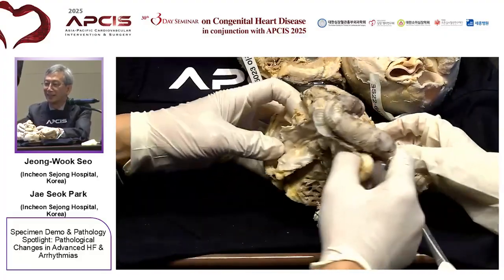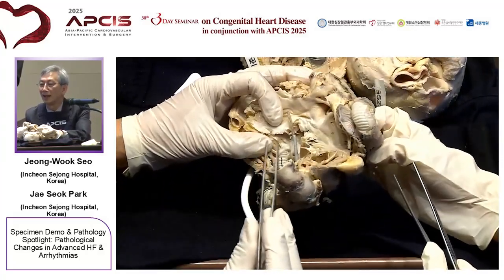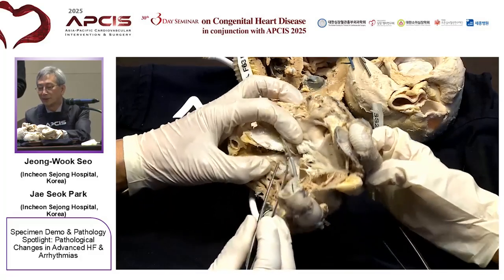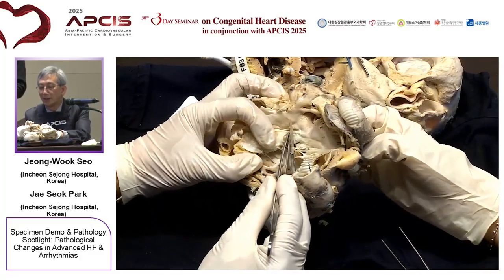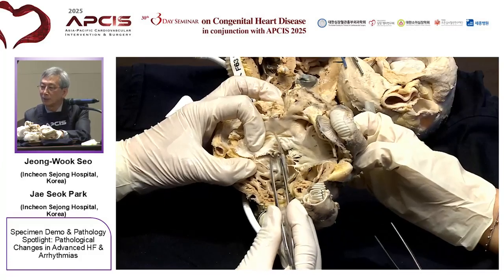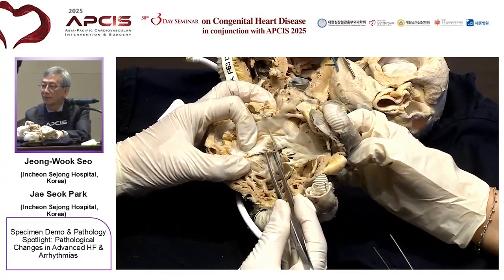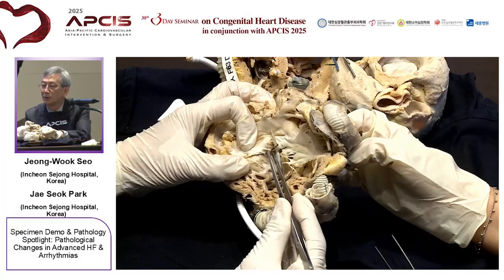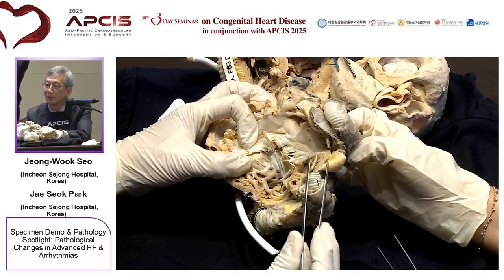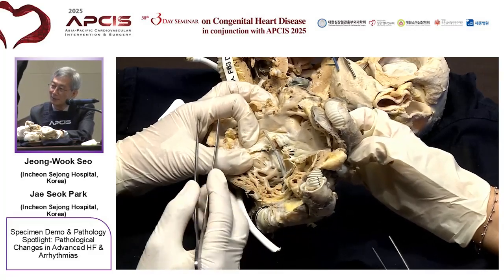Yeah, it's not easy for you to follow the anatomy, because this is a shrunken heart after HeartMate 3, and so this is the CSP lead just below the tricuspid valve orifice, and then it penetrates at a right angle to the septum and approaches the left ventricular subendocardium, which was insufficient in this case due to fibrotic change of the left subclavian vein approach site and so on. Thank you.